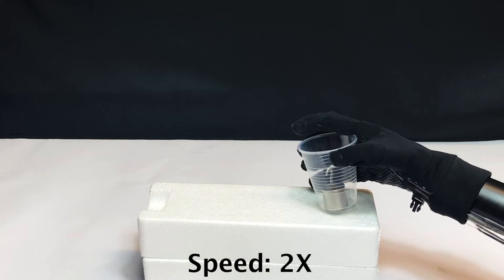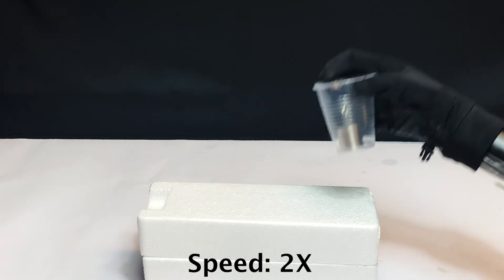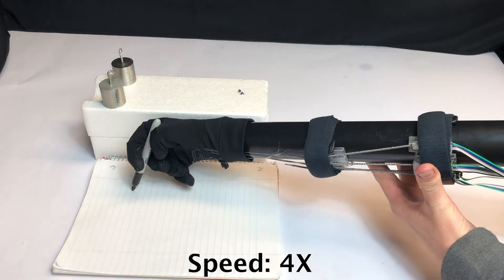Picking up a deformable cup with a robotic hand. Picking up a pen. Picking up a marker and writing.